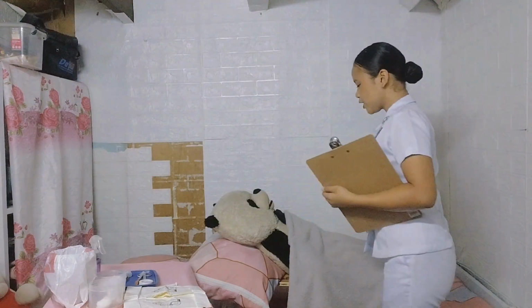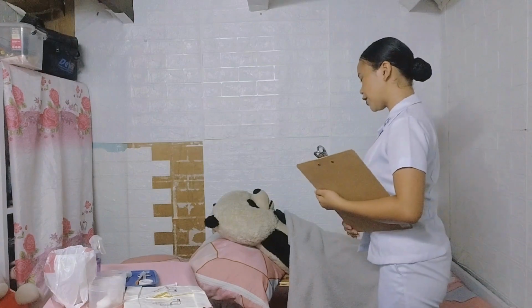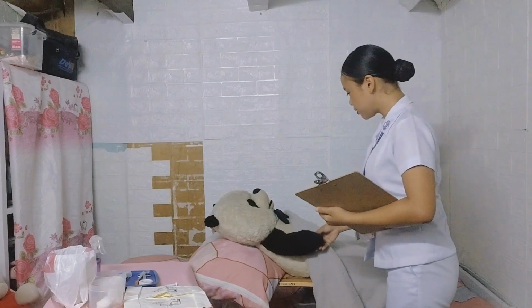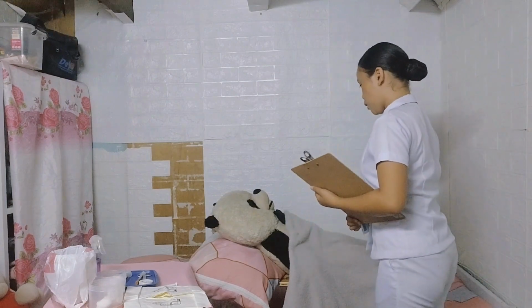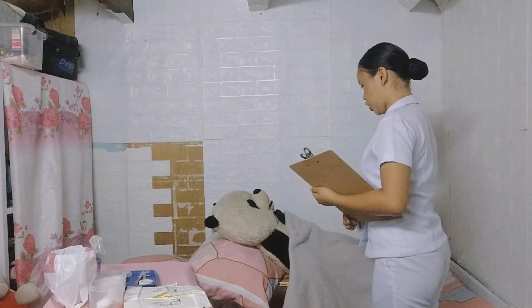Good morning, sir. I am Karil Faye Buka, your student nurse for today. For verification, sir, may I see your wristband? Please state your complete name and your birthday. Today, sir, I am going to give you the medication through intradermal injection.